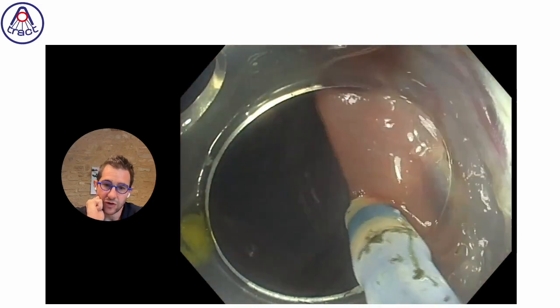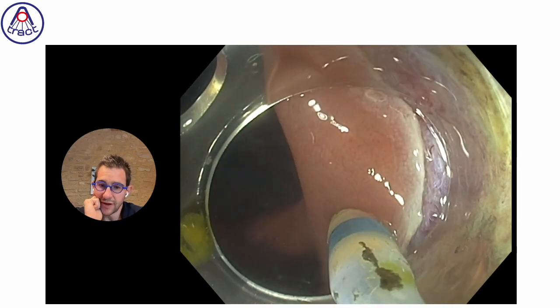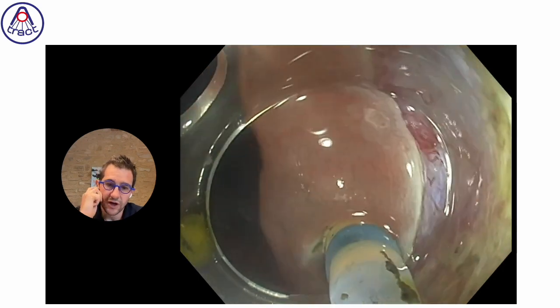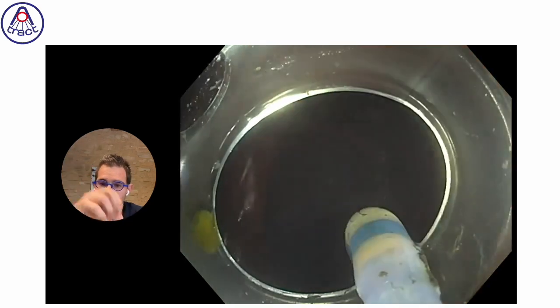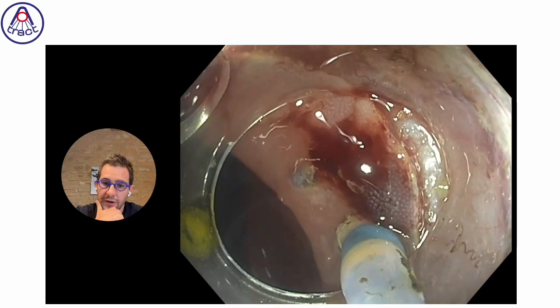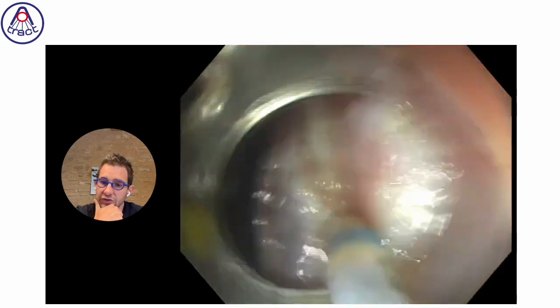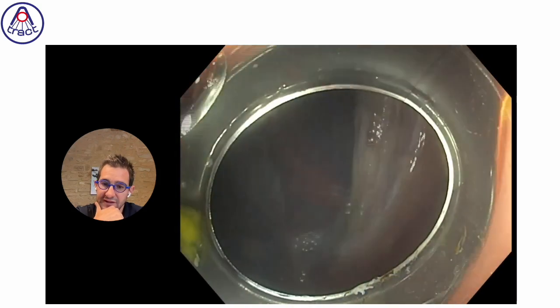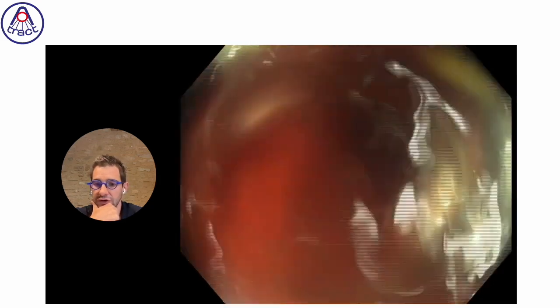So we decided to close this area with clips, but to avoid slipping, and because the new clips with possibilities to catch the tissue are not available now, we do this small incision around to facilitate grasping the tissue without slipping for the current clip we have.